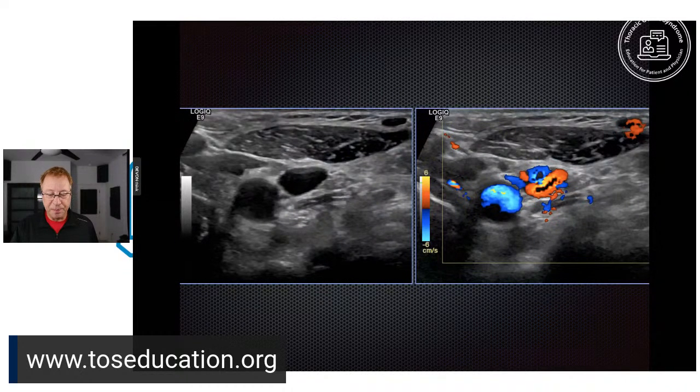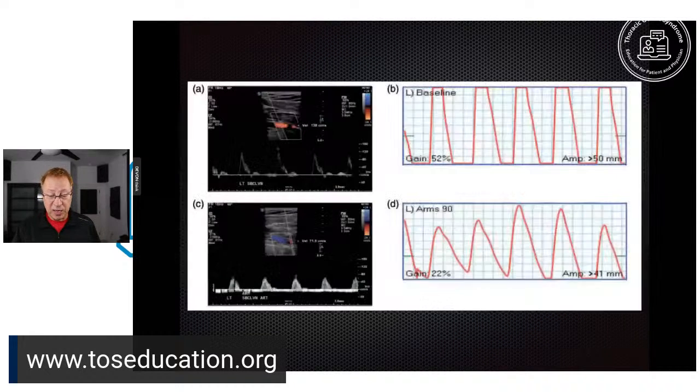That's not great. Now, look at the image on the left, compare it to the same level on the right. You can see all this color added in. That's blood flow. So ultrasound has a great property of being able to measure blood flow, to look at the waveforms as the blood flow goes by and assess them.